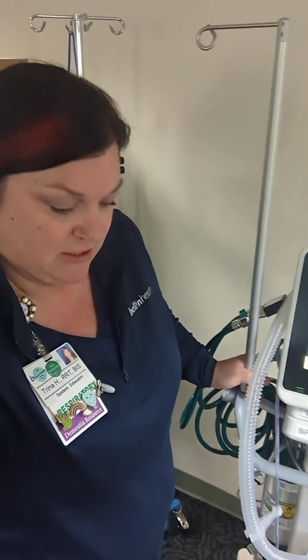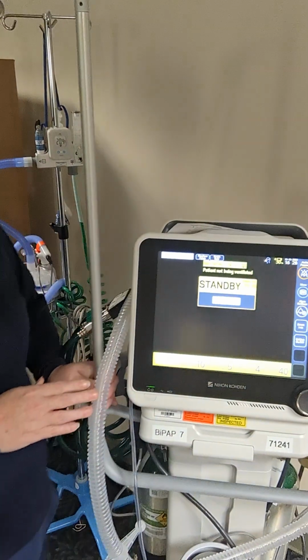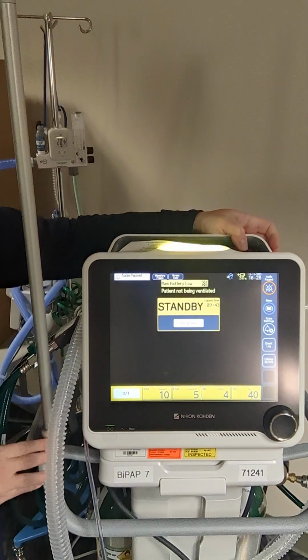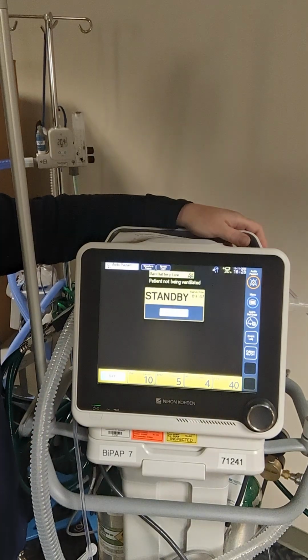So this is, let's see, bear with me. Okay, so this is our BiPAP machine. And what we're seeing here on the display, try and get rid of that glare. Okay, so our machine has a few different settings.